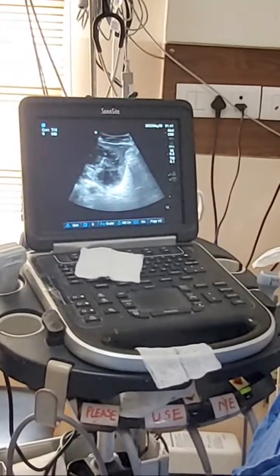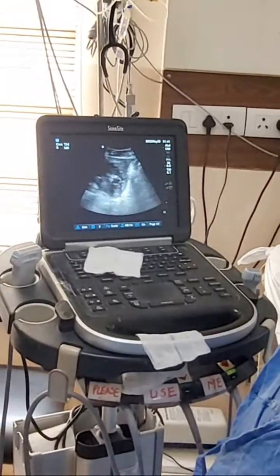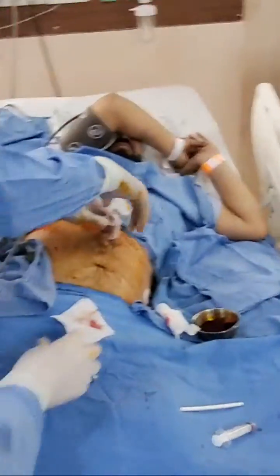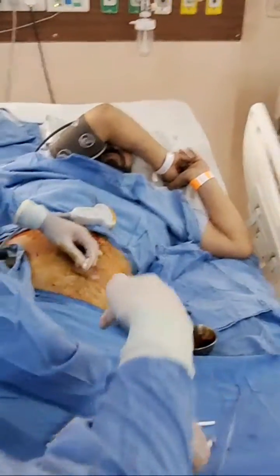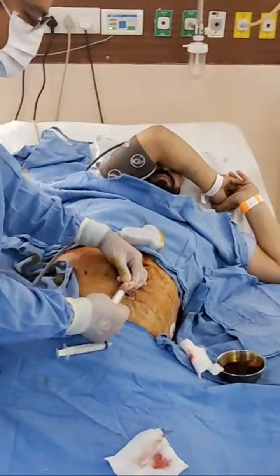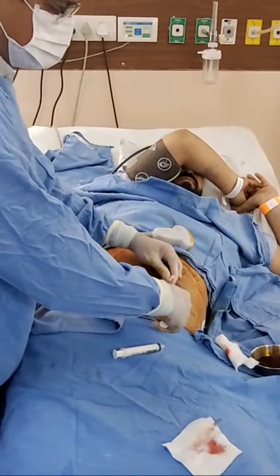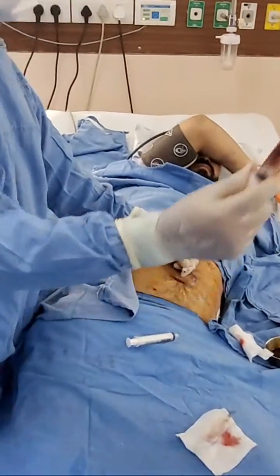Yes, sir. This cavity was all over. Lock, apply. Put aspirate to see what you get. What you get is thick pus. So, that's a pus here.